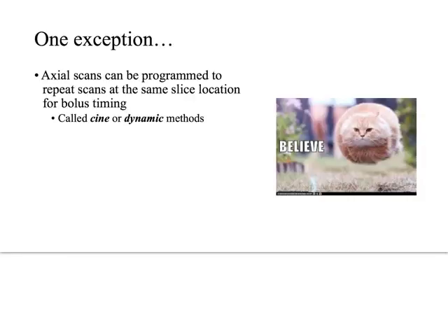So this is one instance that I can think of where axial imaging would be useful, is if you're working in the interventional suite assisting doctors in localizing needle placement. If you're not doing that, there's probably no reason other than that's what we've always done for doing them.